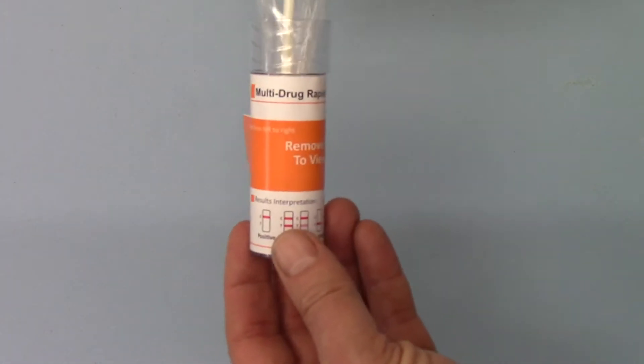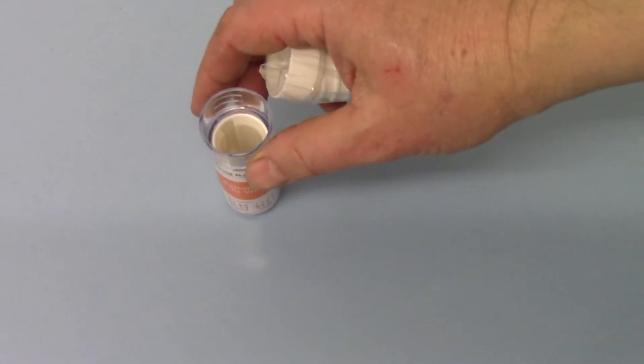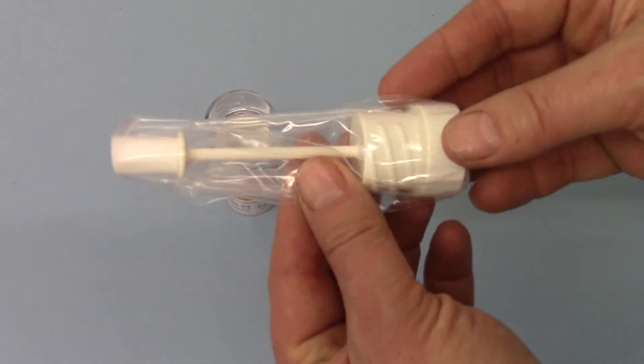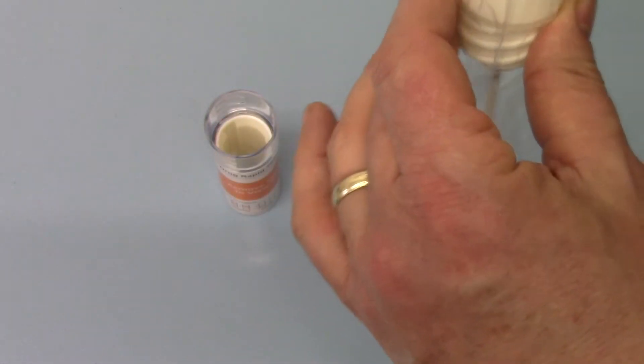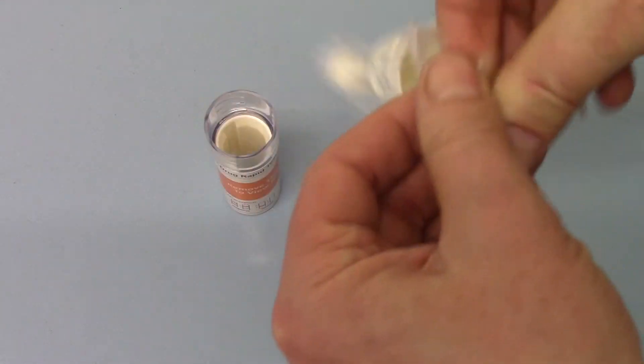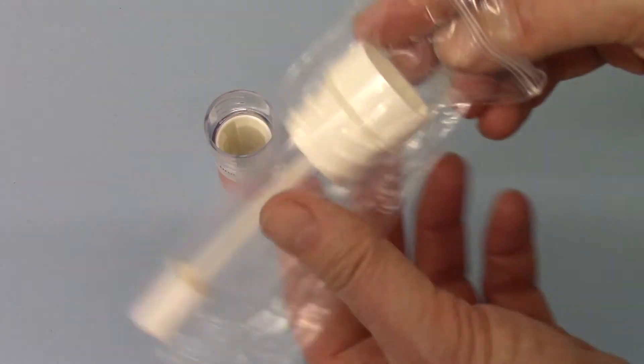And this is the actual test device. You'll see it comes in two parts. The swab collector, which is in its own little plastic pouch which has to be opened. This is resealable for disposal.